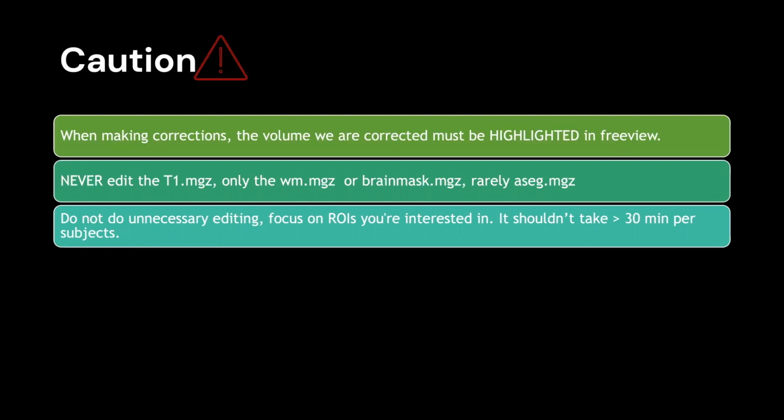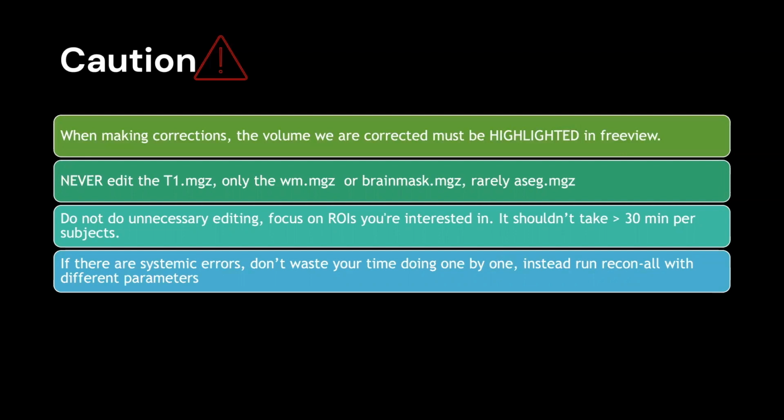To be fair, once you get the gist of it, it will take somewhere between 10 to 15 minutes per subject to basically check that it's fine and that everything is okay. If you see that there are systematic errors, don't waste your time doing one by one. Instead, just run recon-all again with different parameters. For example, if you see that all subjects still have a lot of skull, you can use a specific command to run them all again with a stricter skull stripping.